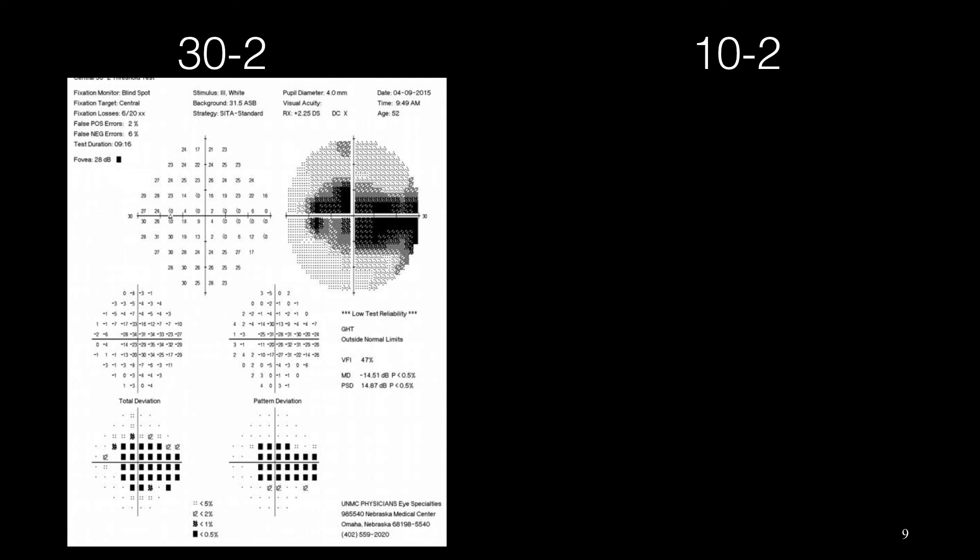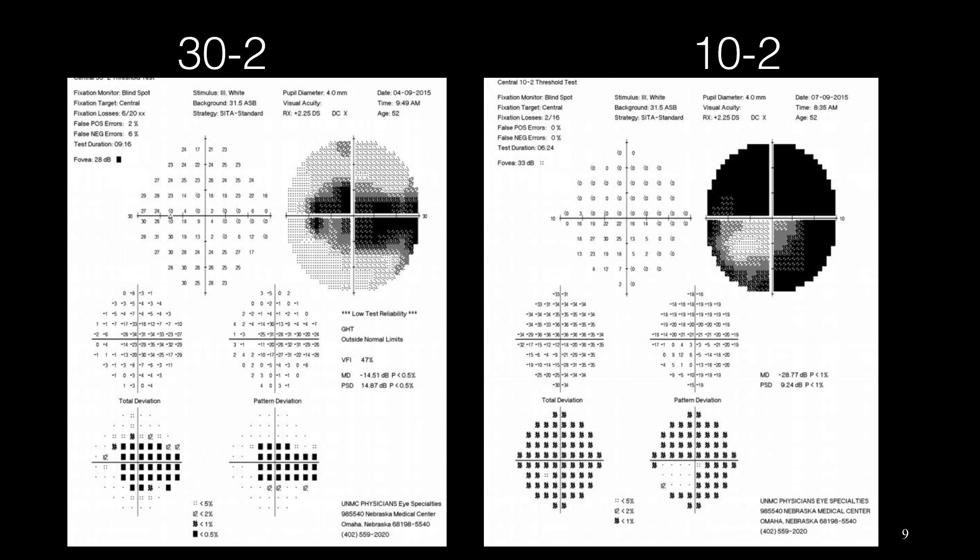This is an example of a patient with central scotoma. As you can see, there is no point with threshold value at the central part. But if we check 10-2, because we are checking more points, there's greater chance we can find some points with threshold value, which could be really helpful for follow-up and checking the progression of the disease.